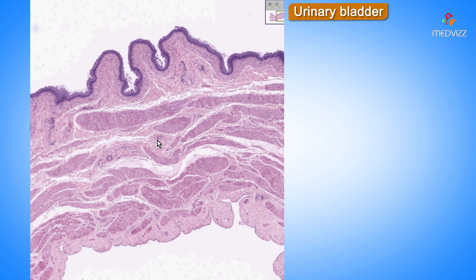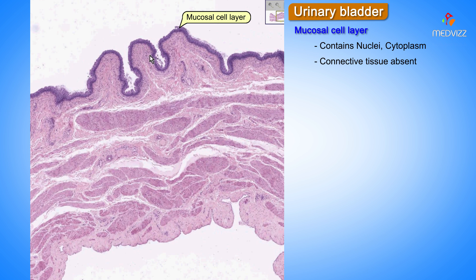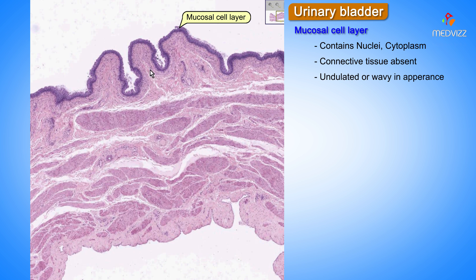Here is the most beautiful bladder you will ever see. Notice, like in many of the things we have been discussing, the mucosal cells are basically bluer because they have chiefly nuclei and cytoplasm and no connective tissue, which is why they look bluer than the underlying connective tissues. Notice it has kind of an undulating or wavy appearance, certainly not really papillary, and then notice the majority of the thickness of the bladder is smooth muscle bundles arranged in whichever way they have to be arranged to do their job.